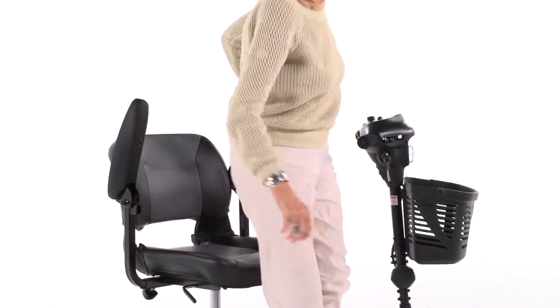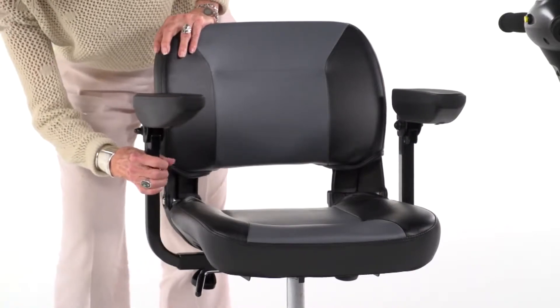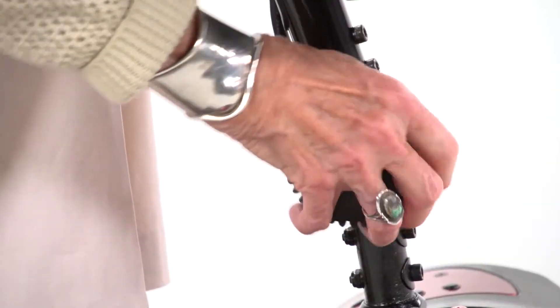The padded armrests are contoured for comfort and flip up for convenient boarding and exiting of the scooter, and the armrest width can be adjusted to best fit the user. Plus, the tiller's angle is adjustable to position the controls in the most comfortable driving position.